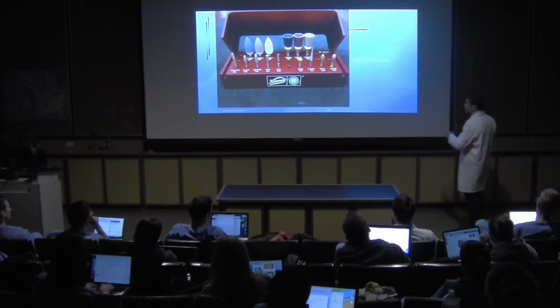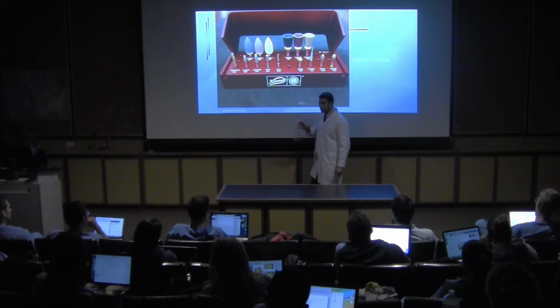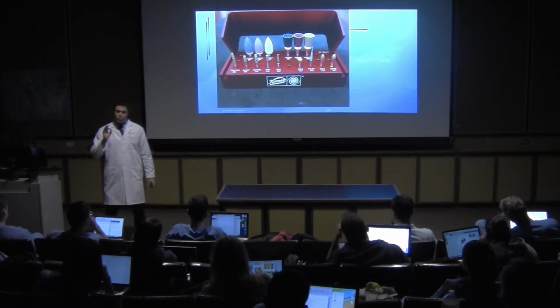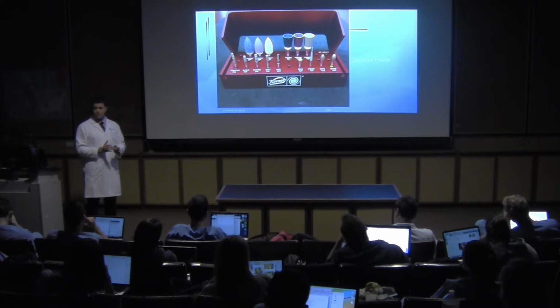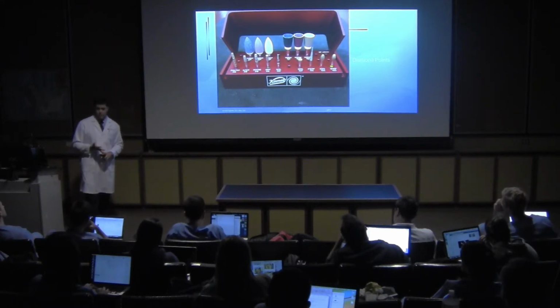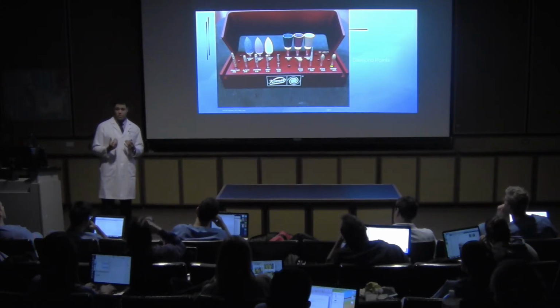And the important thing is that for this type of preps, we will have a specific diamond point shape to work with that. It's similar to the class 1, class 2 preps. If we were working with 330 or 245, the shape of the bur will give you the characteristics of our prep.